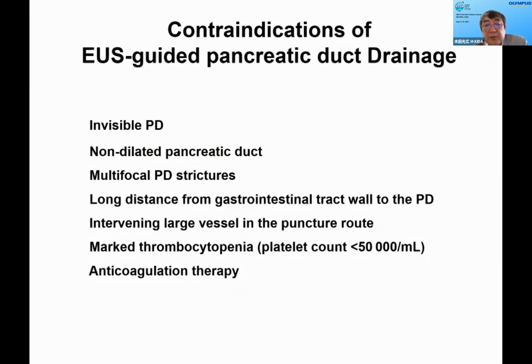So the contraindications of the EUS-PD are such as invisible pancreatic duct, non-dilated pancreatic duct, multifocal pancreatic duct stricture, long distance from the GI tract, intervening large vessel in the puncturing route, marked thrombocytopenia, anticoagulant therapy, and so on.